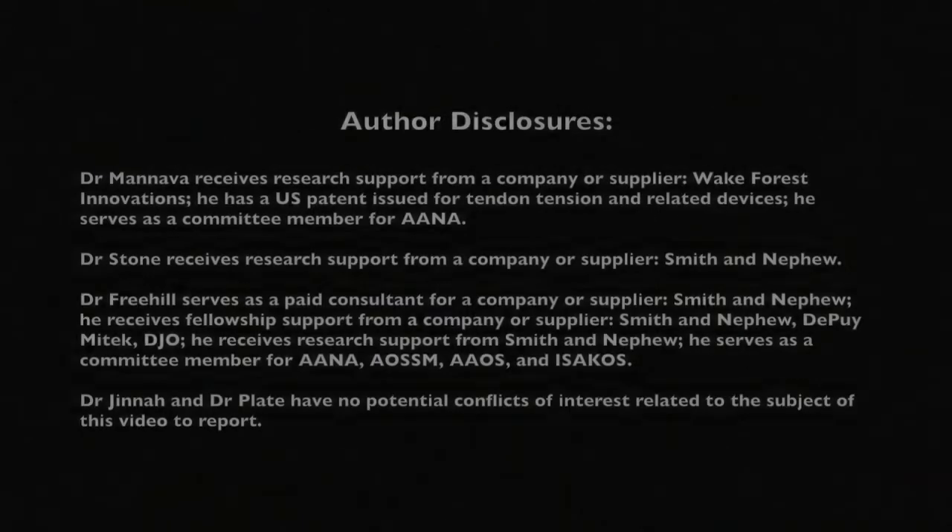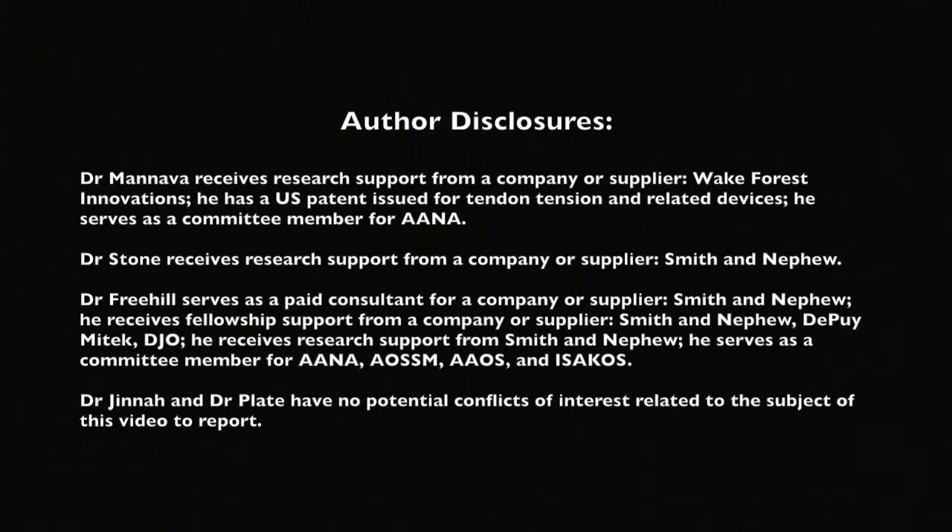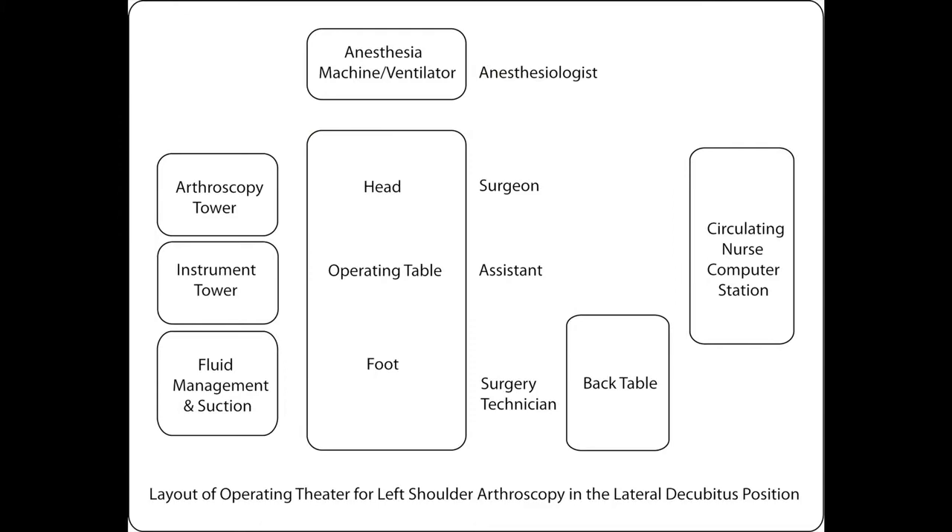The basic operating room setup consists of the surgeon and assistance along with the back instrument table being located posterior to the patient, and the arthroscopic equipment is located anterior to the patient.